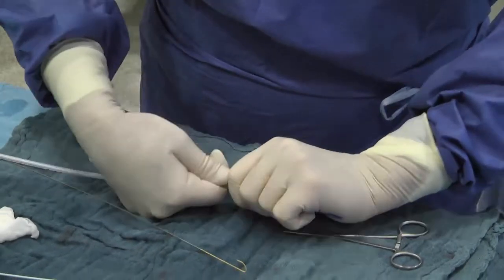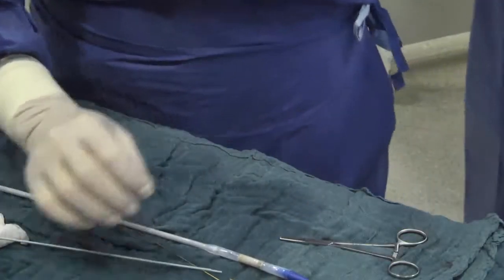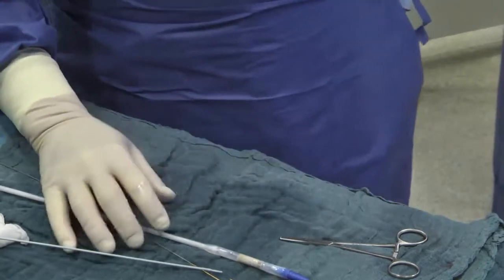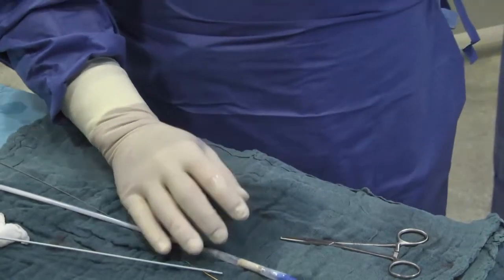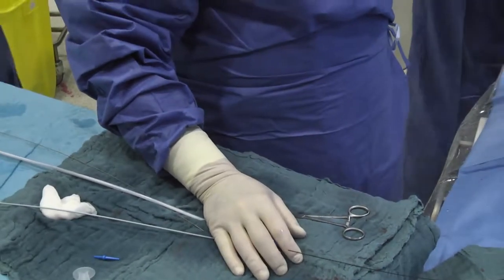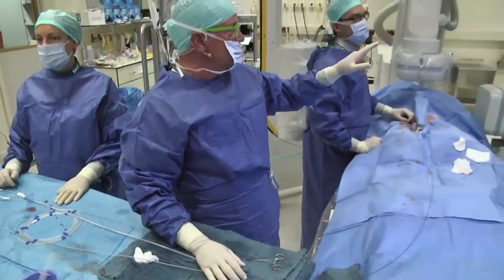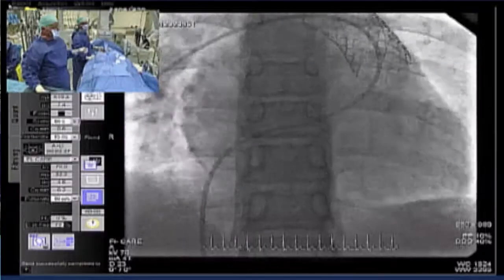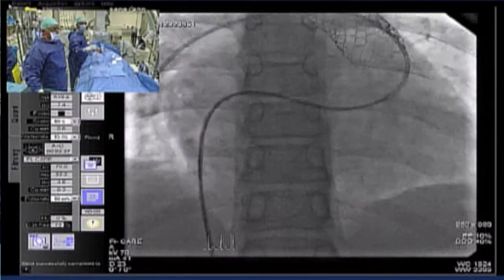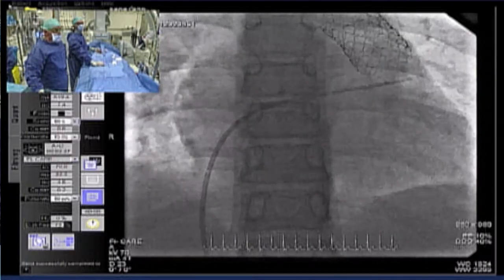We're there. We still have to make first our angio, but allow me now to go to the images that we have seen so far. So can I get the review on the A screen? The review. Give the review A. Review A. So this was this morning. Yep, we see that. We crossed it with a balloon-tipped catheter.